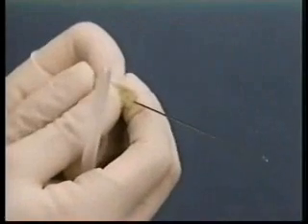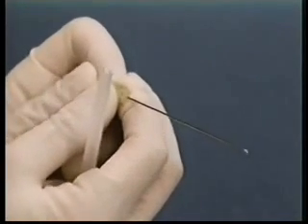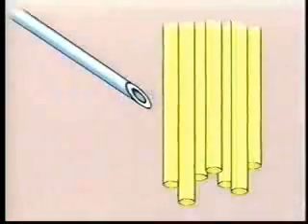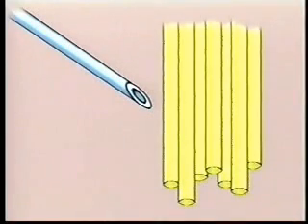The bevel should always be pointed cephalad with respect to the patient. Examine the spinal needle. The stylet should move in and out easily. The needle should be tapered with smooth edges. Spinal ligaments run in a longitudinal direction. With the bevel up, the narrowest part of the needle will initiate the opening, which will separate the ligaments smoothly, and on removal, the ligaments will seal tightly.